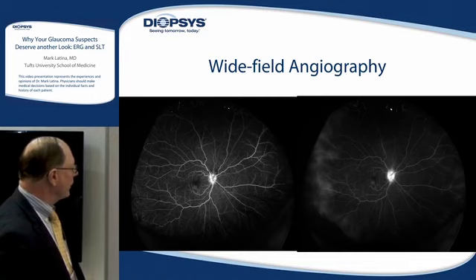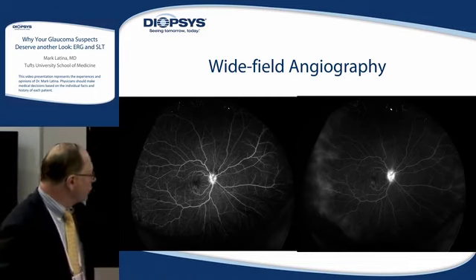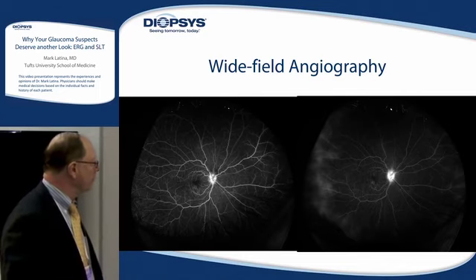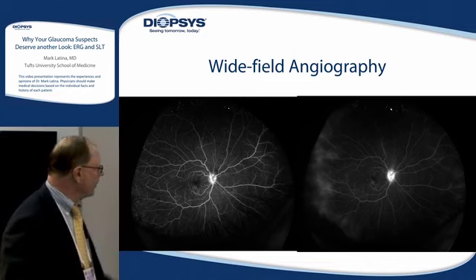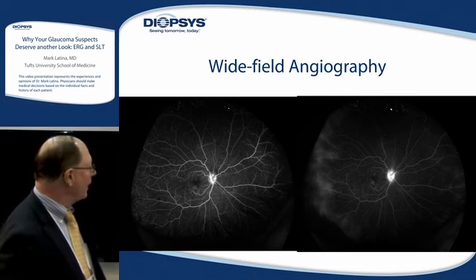This is the wide field angiography, early stage and late. So some disc swelling, changes in the retinal periphery as well, some edematous changes, some leakage in the retinal periphery in this patient, and some RPE changes in the central macula. So these are the retina people.